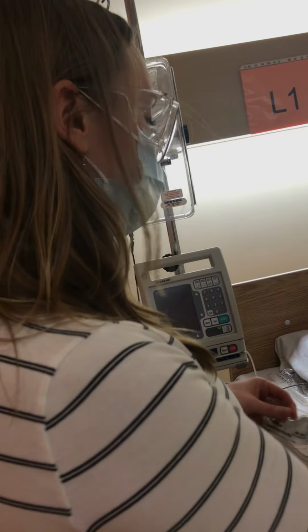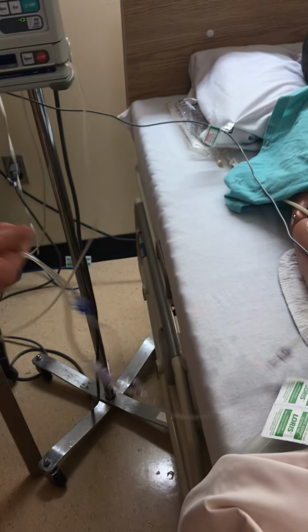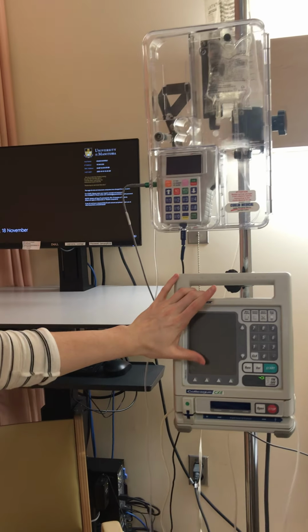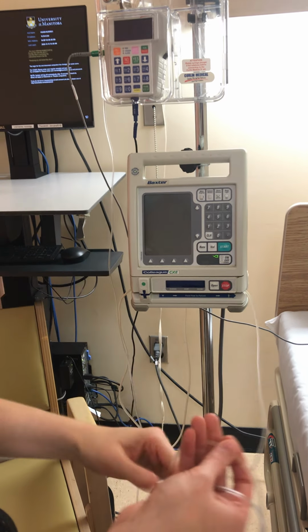So I'll also make sure that I check her vital signs before, particularly paying attention to blood pressure. At this point, one of the things I'm going to do is assess her IV site, ensuring everything is open. I'm going to look at what's running. So she's already got normal saline running. I see that the normal saline is running TKVO on this pump, so it's going nicely.